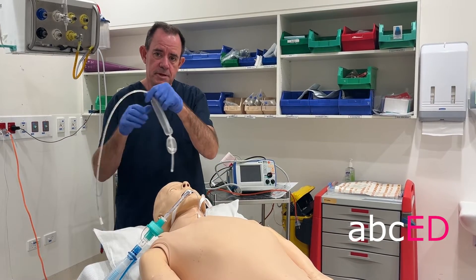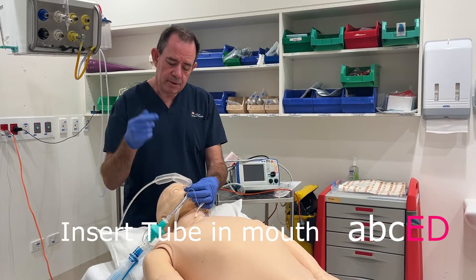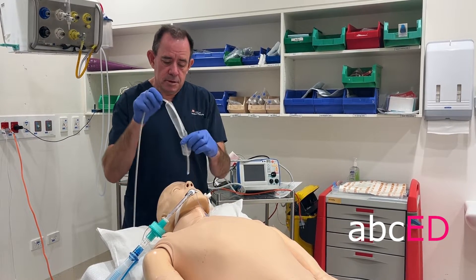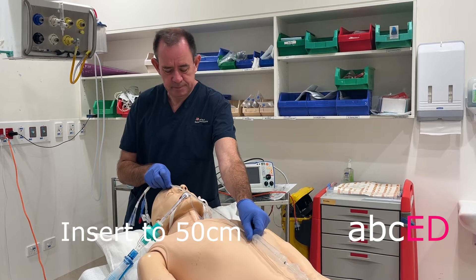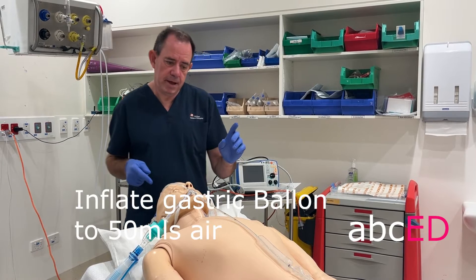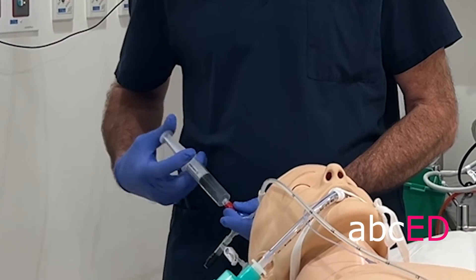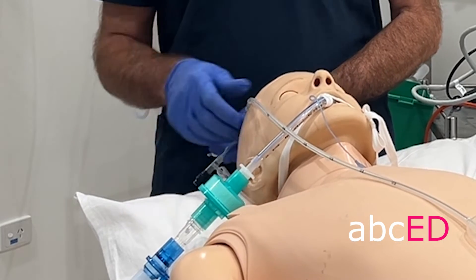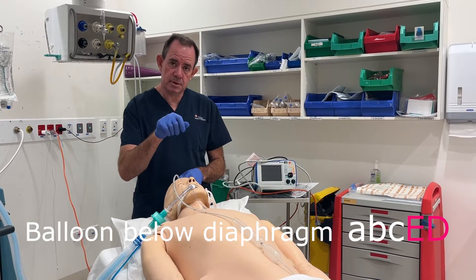The Shen Staken Blackmore tube is an oro-gastric tube, so you're going to put it in the mouth and feed it down. If you need to use McGill's forceps to feed it around the corner, be careful you don't rupture the balloons. The tube is going to go in to 50 centimetres at the lip. Once the tube's in, inflate the gastric balloon to 50 millilitres of air. Pull the balloon back until it anchors, and then take an x-ray to make sure that the balloon is below the diaphragm.